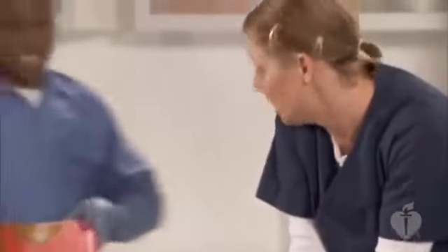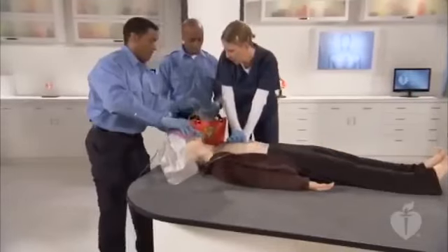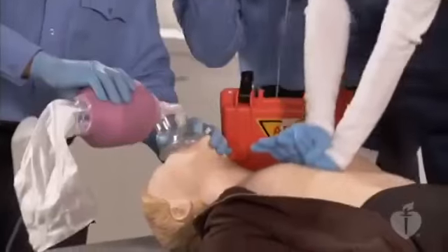One, 2, 3. The code team is on the way. I've got the AED. 7, 8, 9, 10, 11, 12, 13, 14, 15, 16, 17, 18. Attach pads to patient's bare chest. 23, 24, 25, 26, 27, 28, 29, 30.